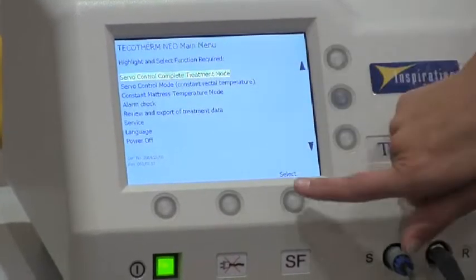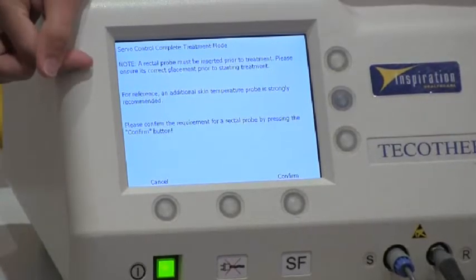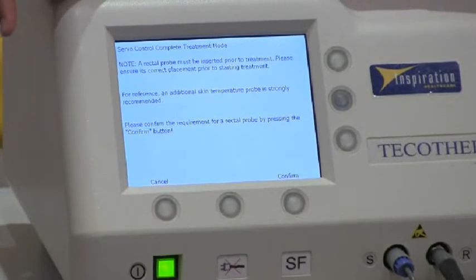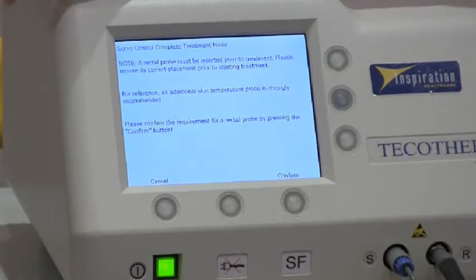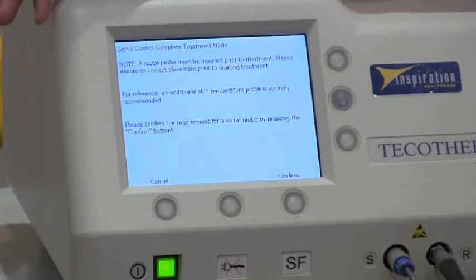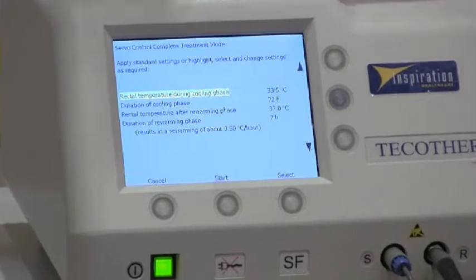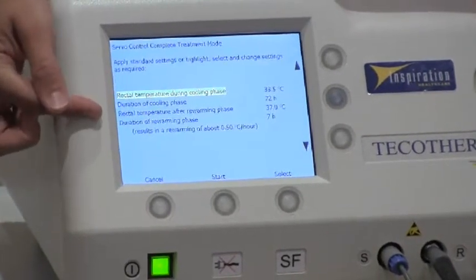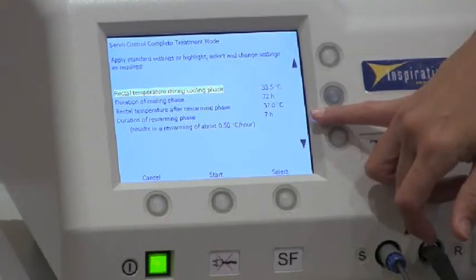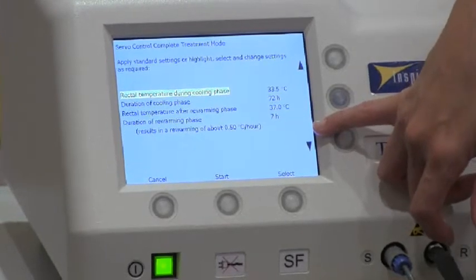To go into this mode, we just select Servo Control Complete Treatment. It will always ask you to confirm that you've got a rectal probe in place, because the rectal probe is feeding back to the system in this mode. Just press Confirm. We then get through to our parameters screen. The default parameters for the system are always those set by the TOBY study.